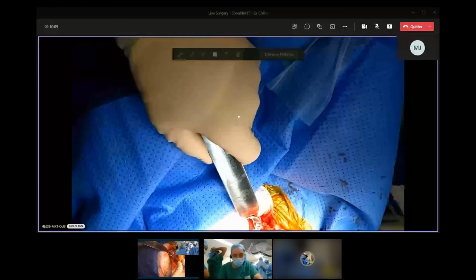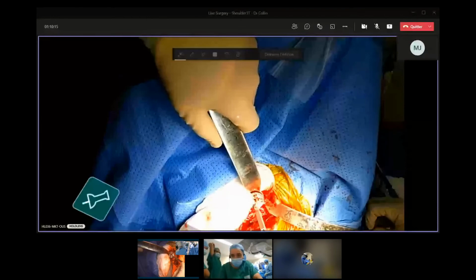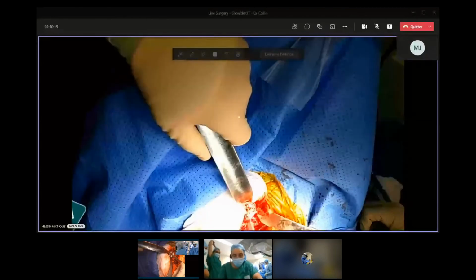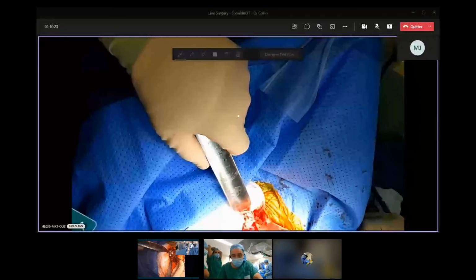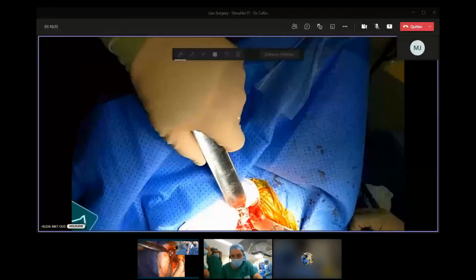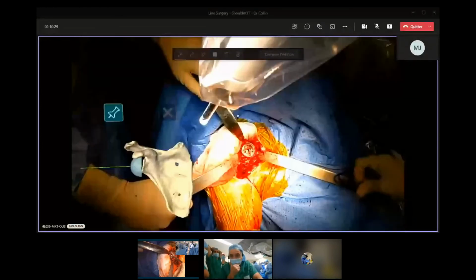I'm going to put it manually because she's an old lady. I don't want to break everything.